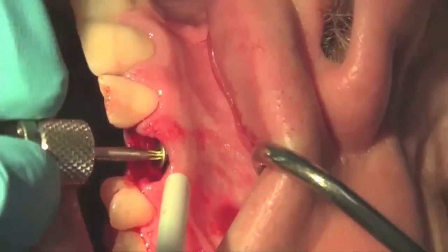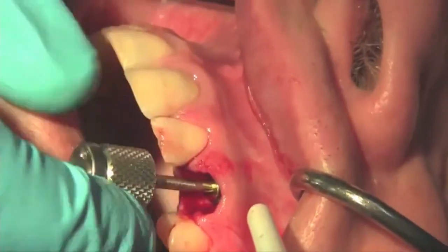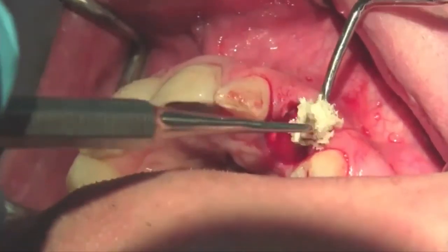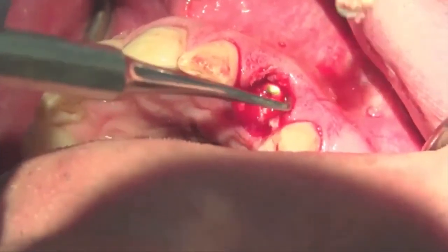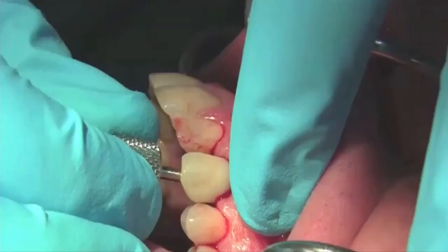We're going to proceed now to put the cover screw in place, and the whole idea of putting the cover screw in place, and not tightening it at this point, is to be able to guide our graft material, which is Puros and PDGF. Puros with PDGF. PDGF is from OsteoHealth.